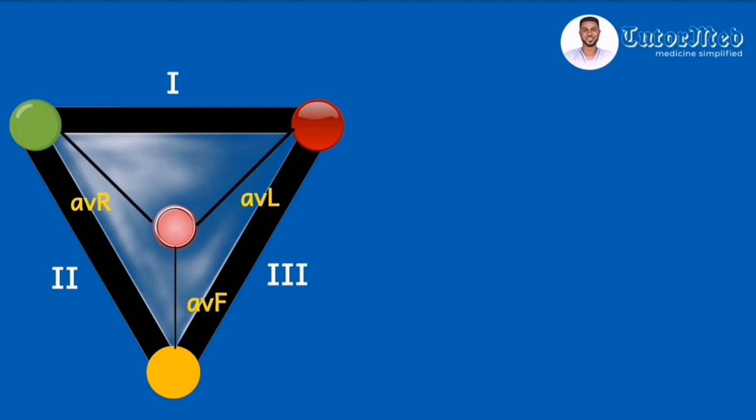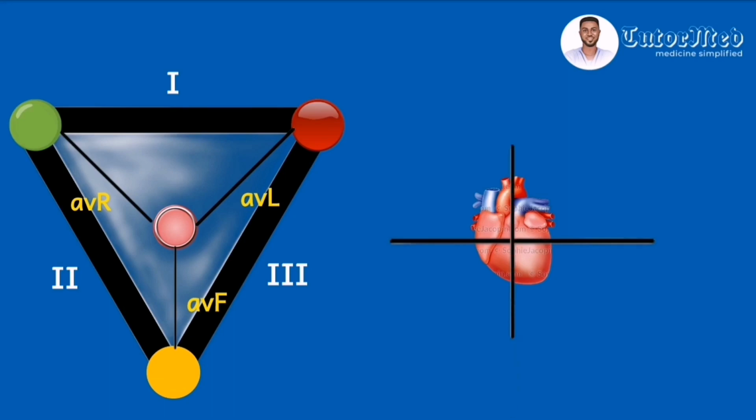And so to position this around the heart, we draw the heart anyhow we want it, and then draw our cardinal points, a horizontal line and a vertical line. Now, look at lead 1 again. It is horizontal and the direction, so we put lead 1 here. Look at lead 2, we put lead 2 here. It makes sense because that's the direction. And look at lead 3, it's in that direction, and so we put lead 3 here.